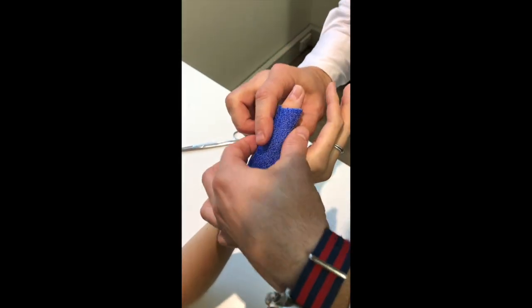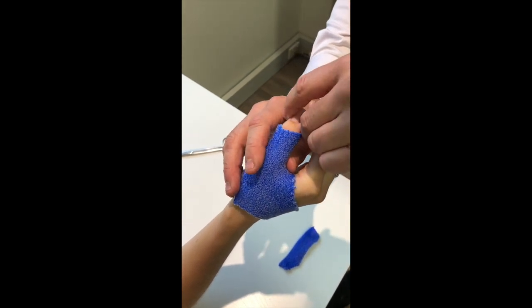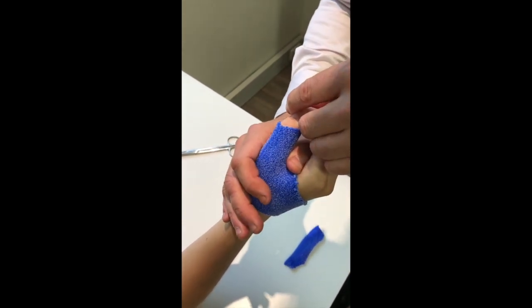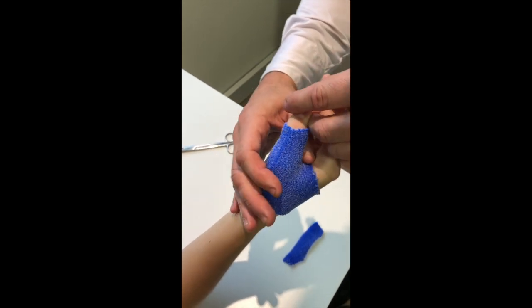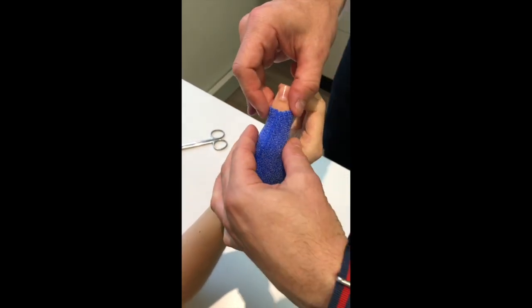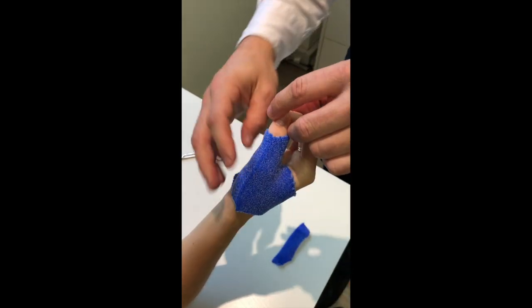This product is just beautiful — you get this lovely seam where you've cut. The final step is just positioning your patient. We want some slight flexion through the MCP joint, a nice neutral position through our MCP. So try to limit radial and ulnar deviation through there.